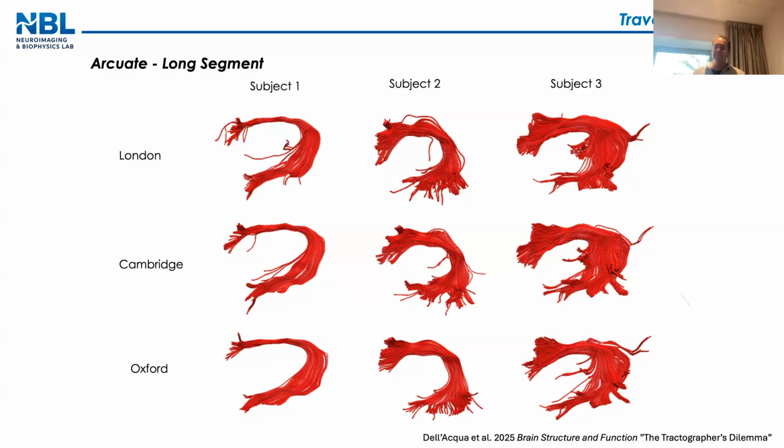So I'm not saying this is a perfect anatomy. What I'm saying is tractography is capturing something that is unique to the anatomy of the individual subject. So we are talking about something subject-specific, precision medicine, this kind of stuff, okay? So tractography is able to do this.